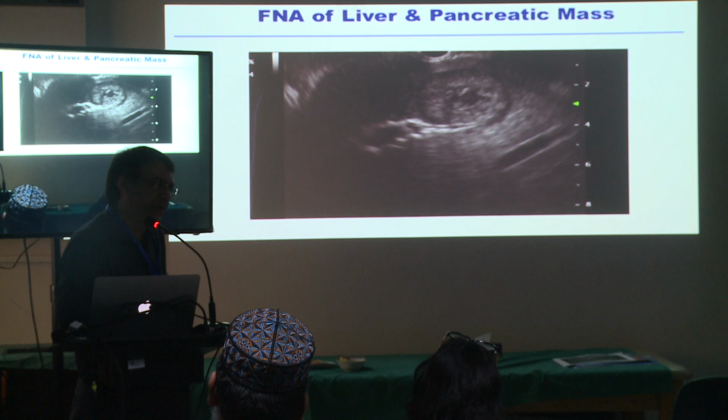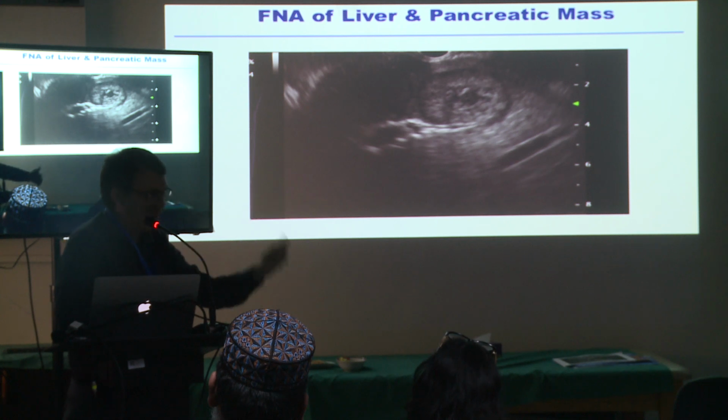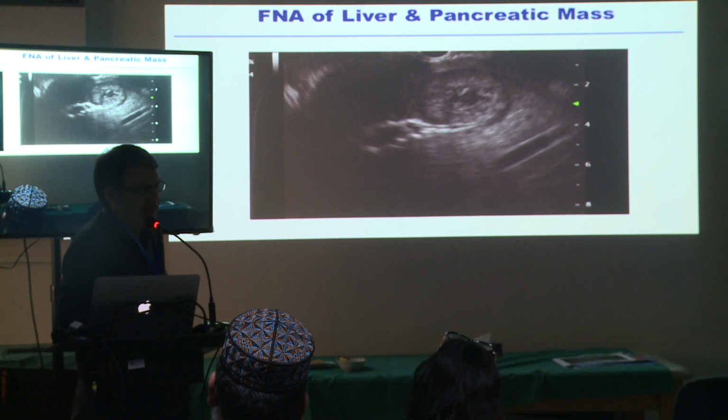No, it's more of a risk. Every time I have seen pancreatitis in my patient, the fellow was not being careful, and I really can predict that this patient is going to develop pancreatitis because they hit the duct. I haven't published that, but I have seen that. Okay, yeah, clearly.